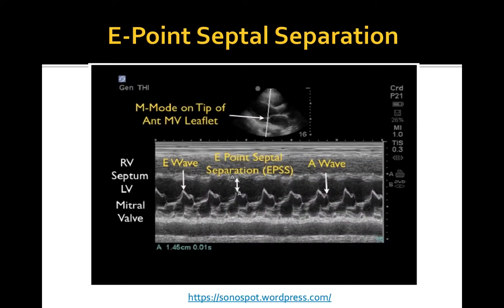M-mode is used to document and measure the degree of mitral valve excursion, known as the E-point septal separation. To obtain this measurement, the M-mode cursor is placed over the tip of the anterior mitral leaflet. As the mitral valve moves during diastole, the M-mode tracing reveals a characteristic pattern of two repeating waves. The first is the E-wave, which reflects the initial and maximal opening of the valve to allow passive filling of the left ventricle. Immediately following is the A-wave, which is usually smaller and corresponds to left atrial contraction.